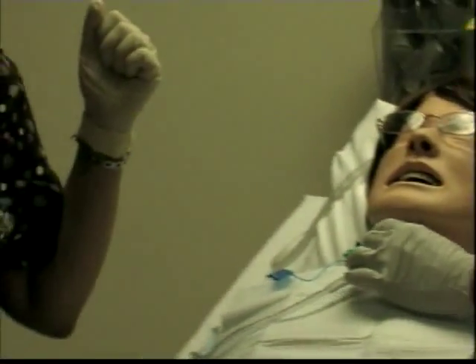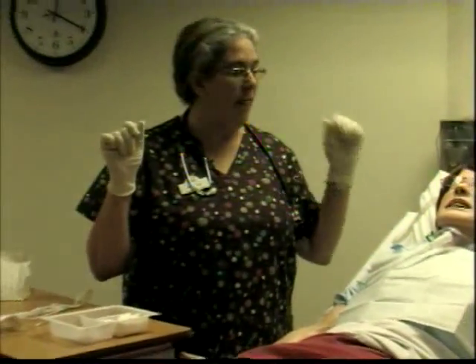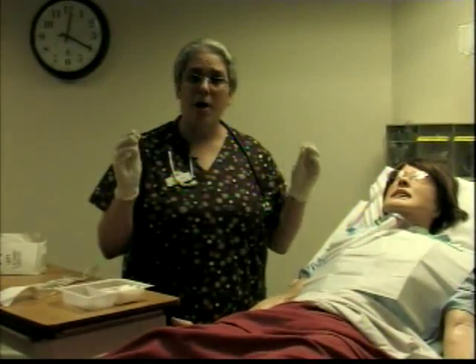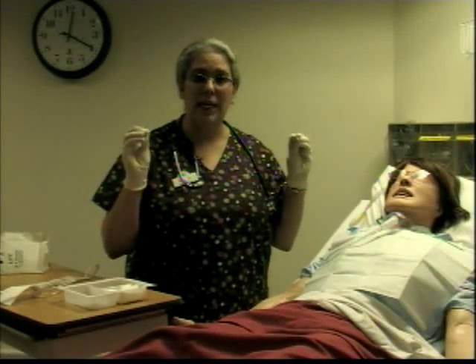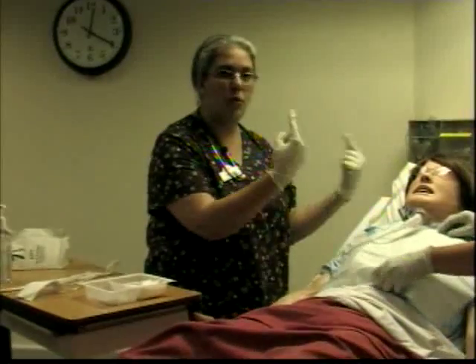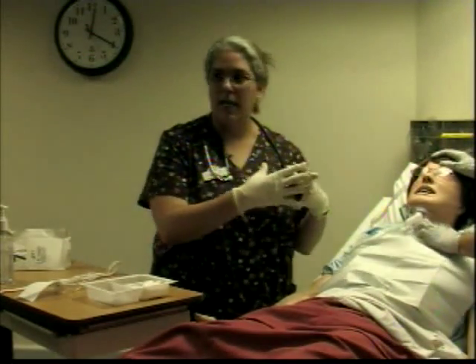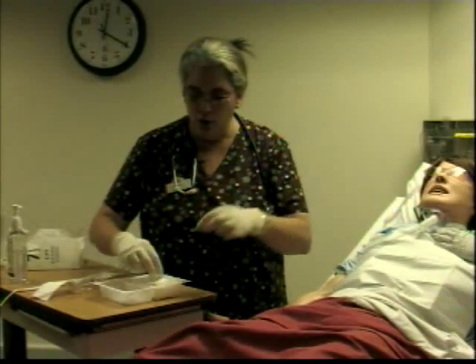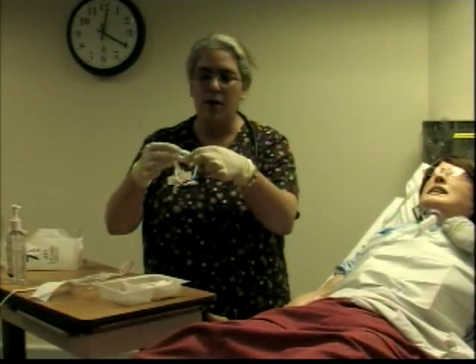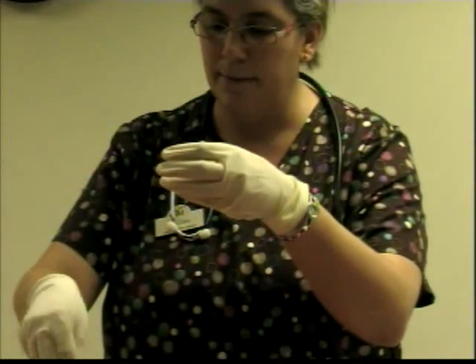So at this point, the patient has not had any break in oxygenation. I have maintained the sterility of the part that needs to be sterile, which is the inner cannula. At this point, it's a clean procedure because we're not going to be doing anything inside the patient's trach. We're only going to be cleaning around the site. So what I wanted to show you is that these are the things that we are not going to be using. So those are things that we just move over to the side.